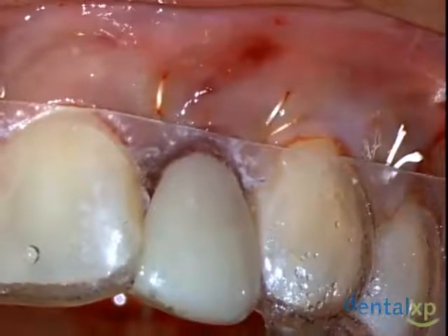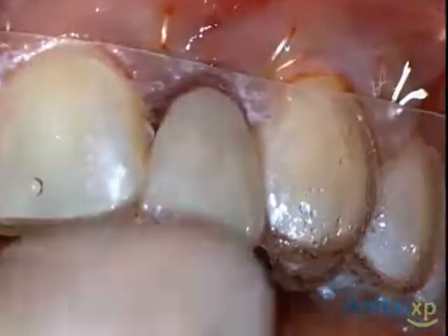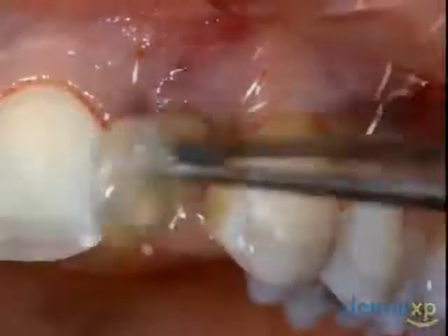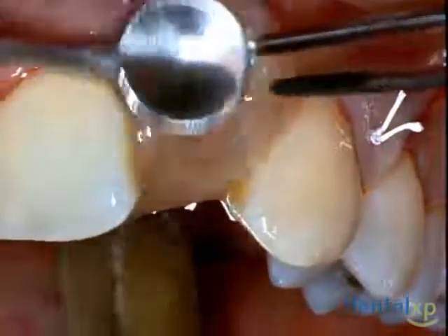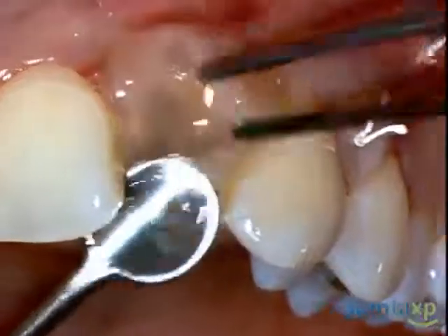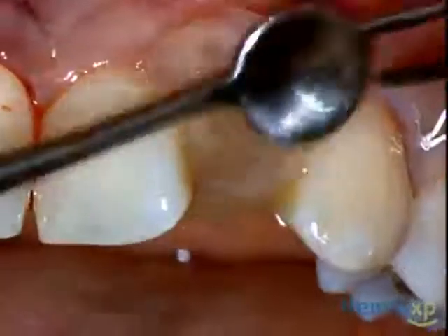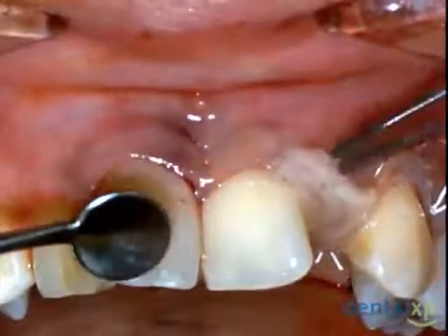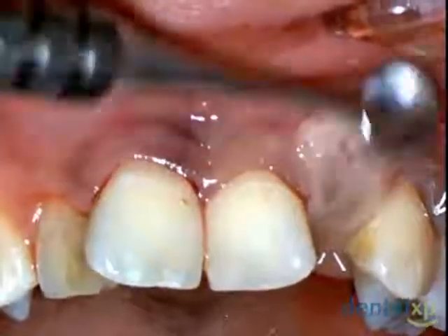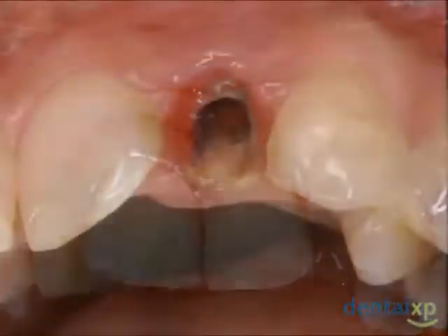An Essex tooth replacement device is then inserted, making certain that there's no pressure on top of the surgical wound. And then once we've relieved this before the patient leaves, a final bit of PRGF material, which has been created into a gel, we call it a PRGF plug, is then inserted over the top of the augmented area. This will be left in place for the first several hours as the patient begins to heal and protect this area quite nicely.